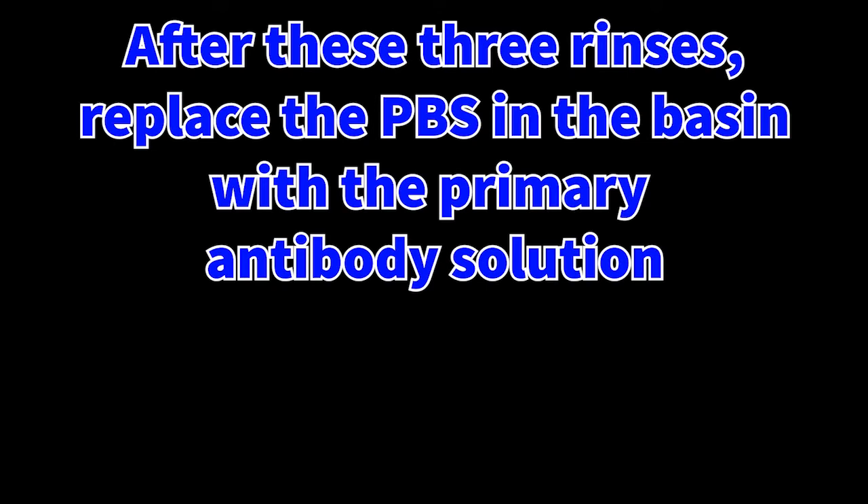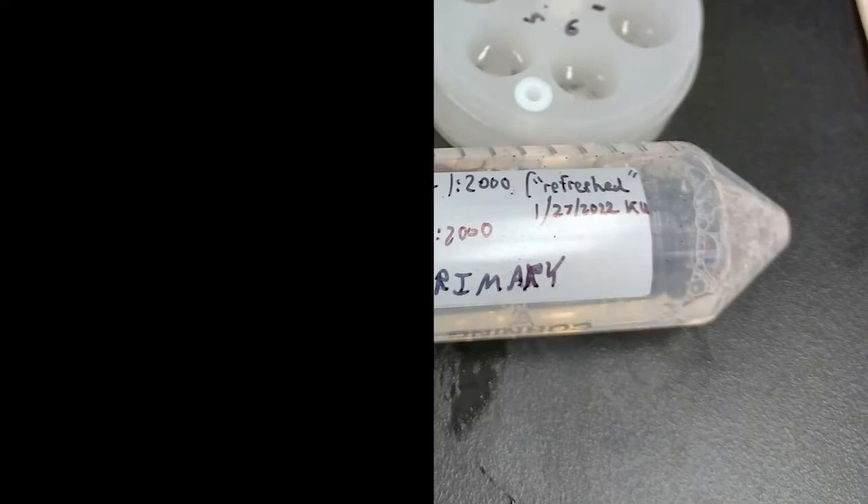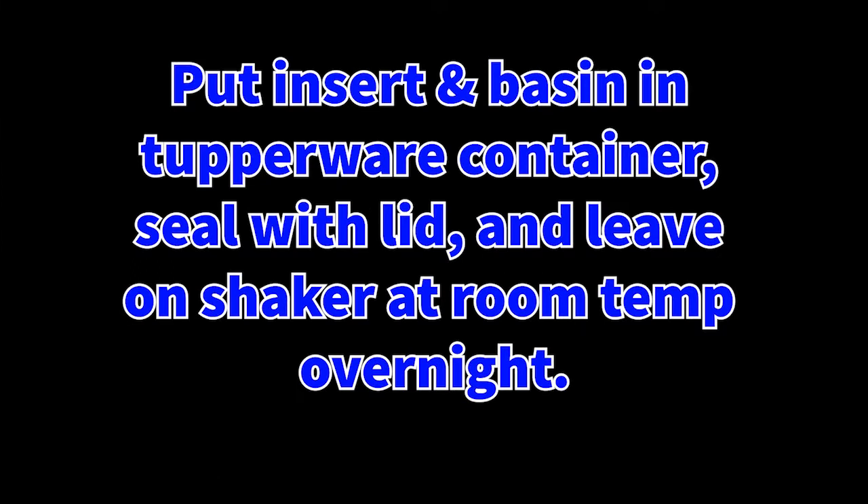After the rinses are complete, you're going to replace the solution in the basin with your primary antibody solution. In this case, I use a cocktail. It's pretty much the same thing of just pouring it into the basin and reinserting the netted insert. When it comes to primary incubation, I incubate it overnight at room temperature, although some other labs prefer to do this at fridge temperature, like 4 degrees Celsius. It's important that regardless of where you're incubating it, you seal up your container in Tupperware in order to prevent evaporation.